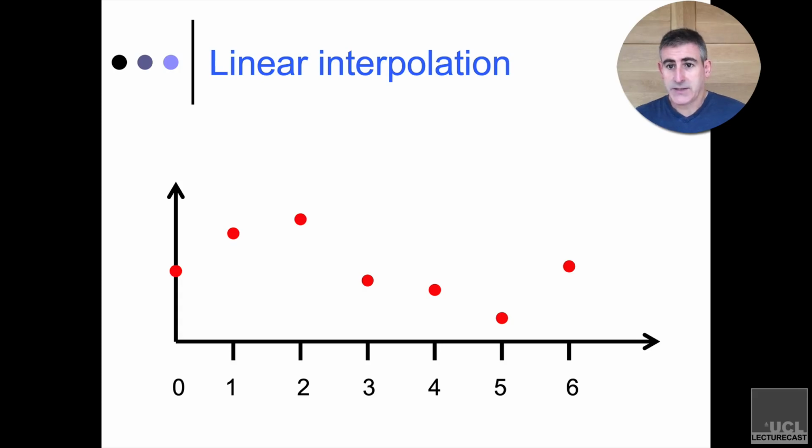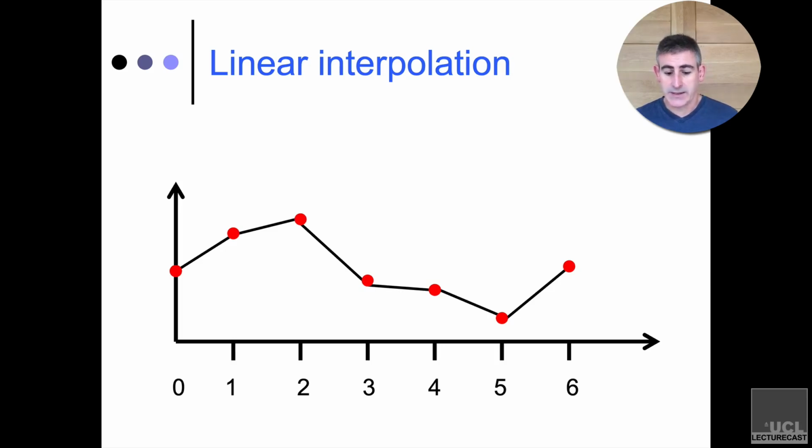Informally, I had suggested that all you can do is average the two numbers to figure out what the value would be. And if you were halfway in between them, then that's fine. But this is an example of what's called a linear interpolation. So if these are the data values that I've recorded at one particular voxel, and I simply drew little line segments between them so that there's a straight line, then no matter how far I'm moving, if I'm moving halfway, then I just add the two together and divide by 2.